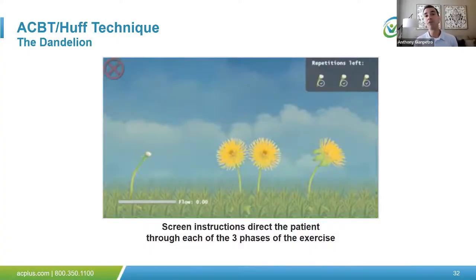And to be honest, I have one therapist who showed me she likes to use this as a piggyback on prehistoric contest, because whereas in prehistoric contest you're launching the javelin, you can think of dandelion as kind of similar when you exhale to launch the dandelion seeds.